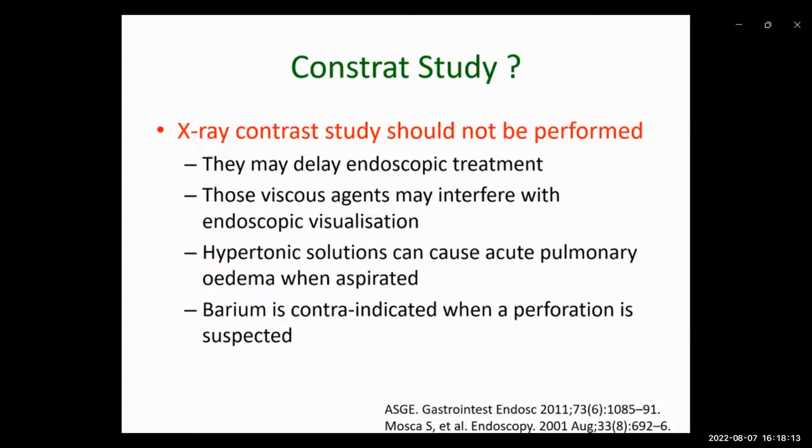X-ray contrast study should not be performed. First, because they may delay endoscopic treatment. Second, because those viscous agents may interfere with endoscopic visualization. Third, because hypertonic solutions can cause acute pulmonary edema when aspirated, and barium is contraindicated when a perforation is suspected.